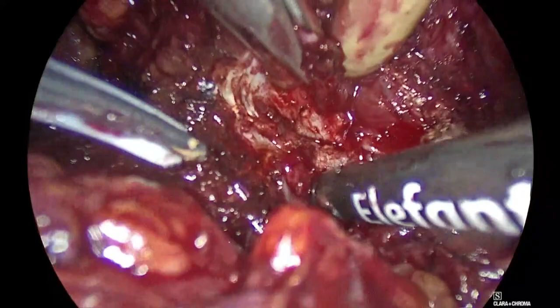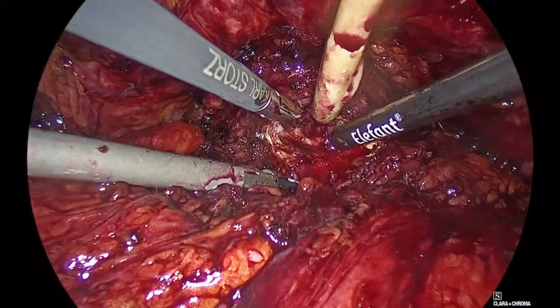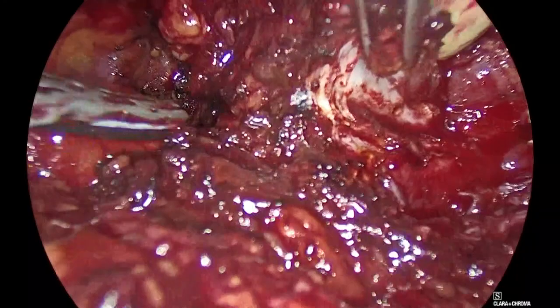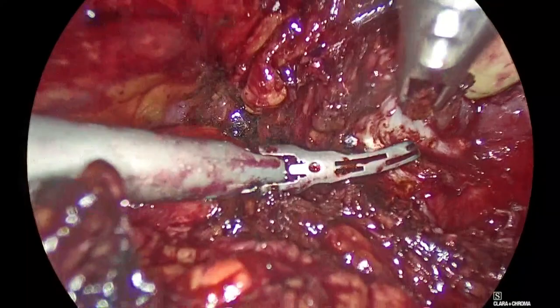Go back, Padelis, a bit. You see this? I'm pulling the prostate out. Come in, Padelis. Panayotis, a bit of thing here inside here. So now what I'm going to do, I have prostate. You see my prostate mark border here. I have bladder here, and I see where the bladder comes out. So I go deep here. Aspirate, Panayotis.